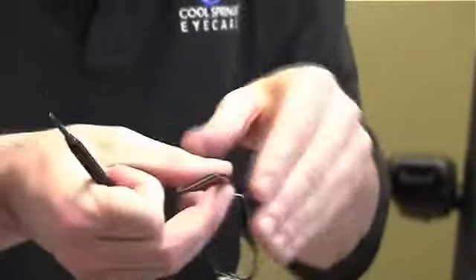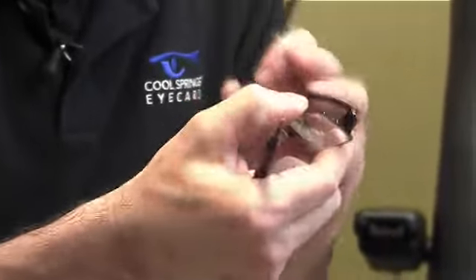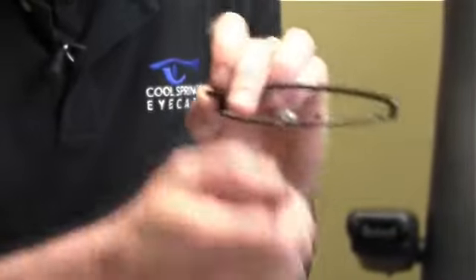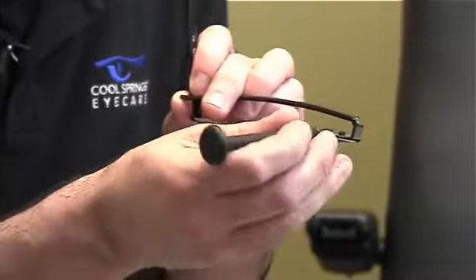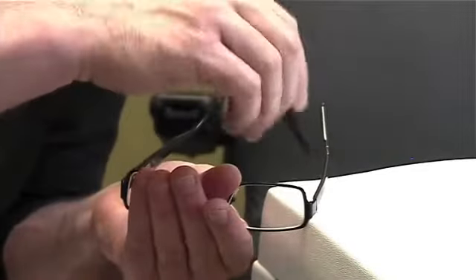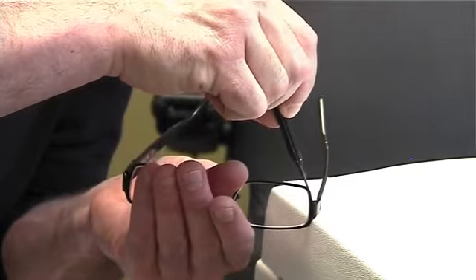Now the other part of the frame that could be tightened is the eye wire where the lens is being held into the frame. And of course there is another screw right there. And if you see, it has the same head as the other screw. You can put it on the table just like you did the temple, almost in the same spot, and line up the head and give that a turn. Just like that.